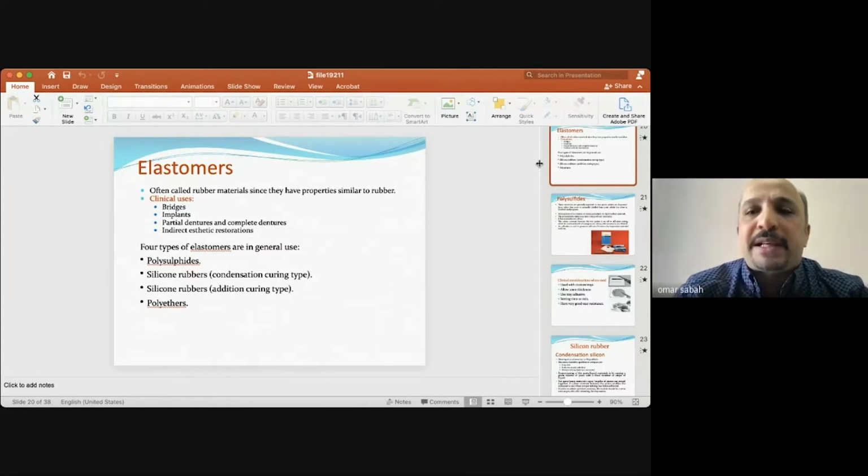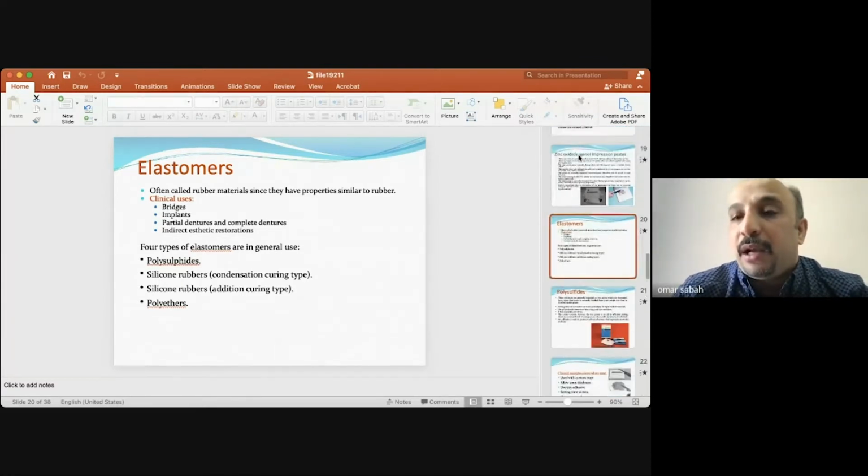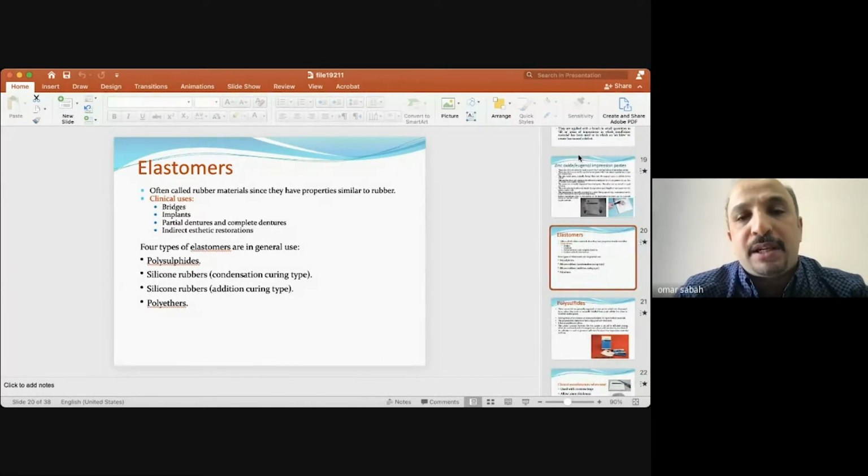One example that you cannot use if the patient has undercuts is zinc oxide eugenol. If you remember, you have two tubes, and you mix them together to get a homogeneous paste, which you put on the special tray that you fabricated and place in the patient's mouth. But remember, no undercuts.